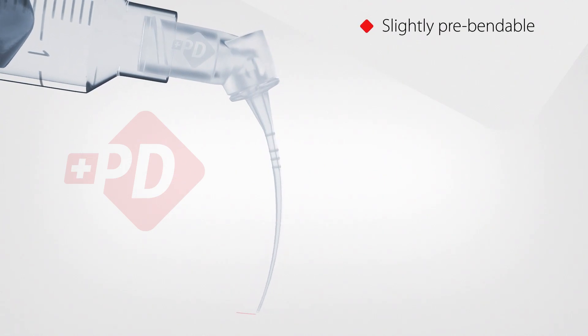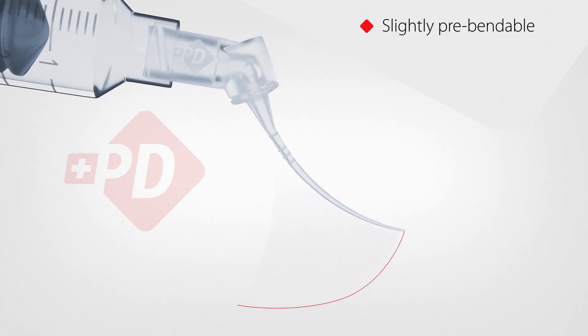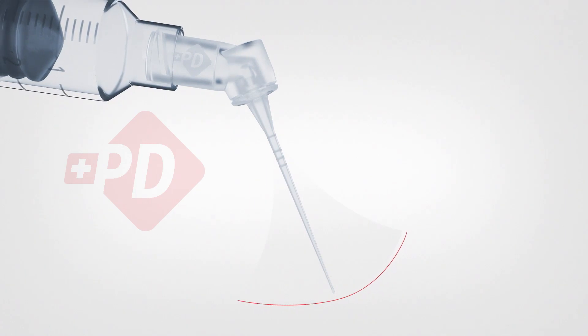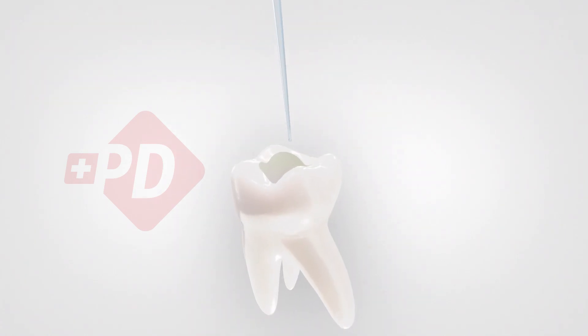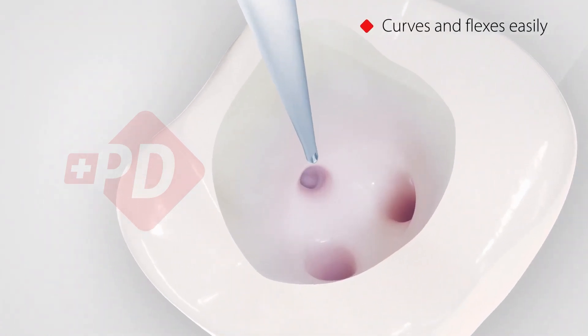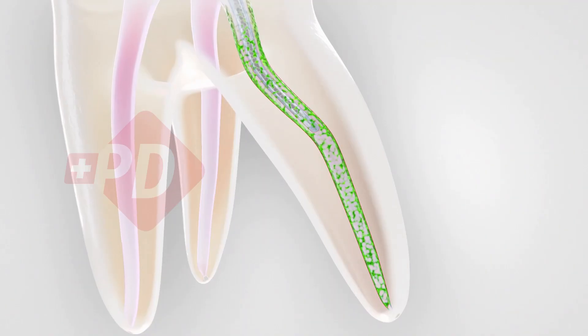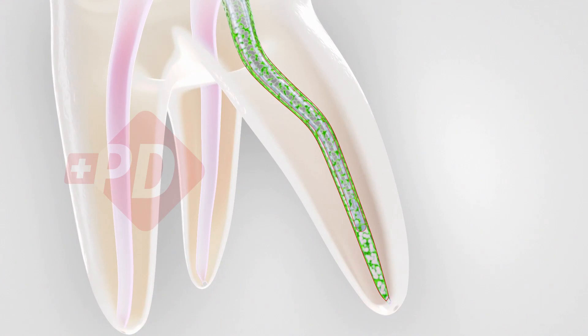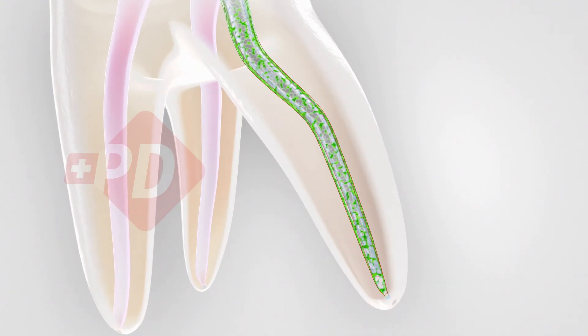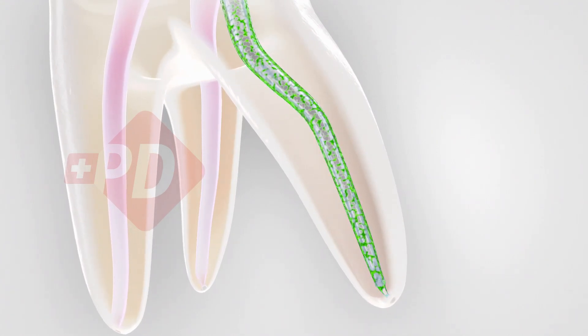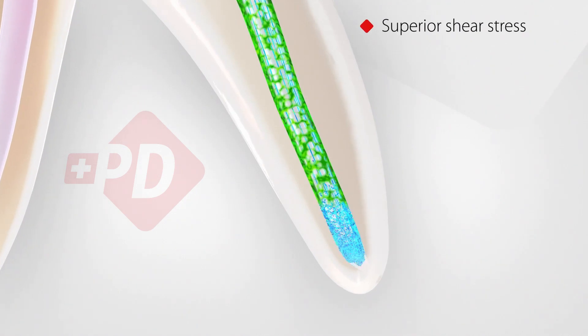If necessary, AIRIFLEX can be slightly pre-bent before insertion. The soft polypropylene body makes the needle curve and flex easily in the most complex root canal anatomy without being traumatic for dentin. The 4% tapered shape matches root canal preparation.